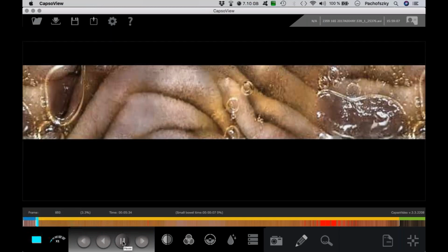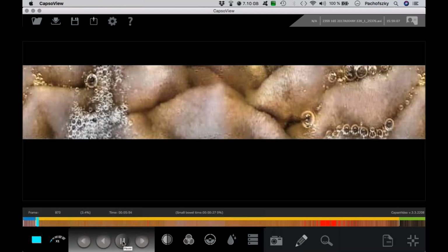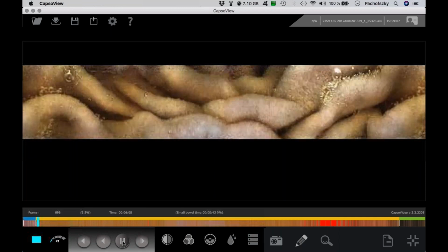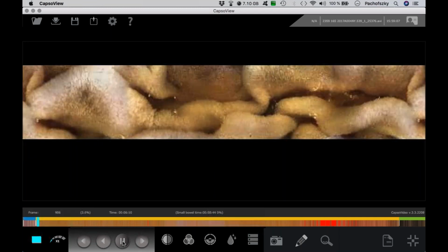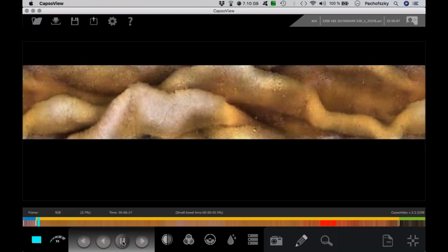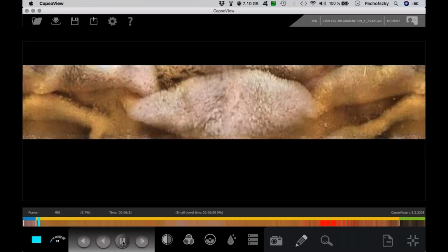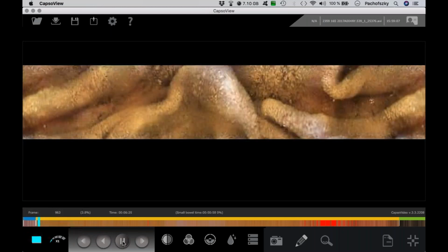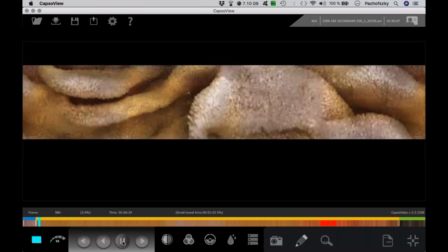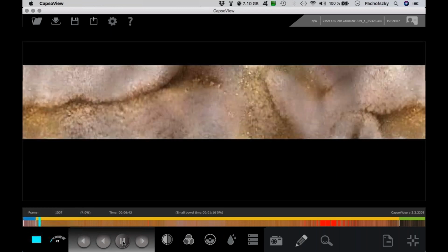I'm not sure if we will find it here now, and I won't spend too much time here in this area because we have not so much time, and I have a lot of good cases for you. So that's the principal start of every examination, where you can get on with it. You will see there's no big problem.